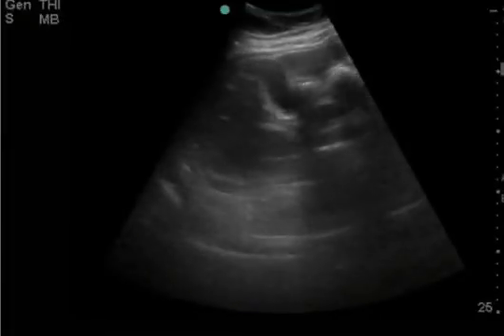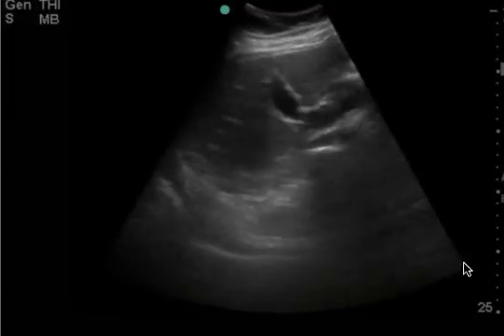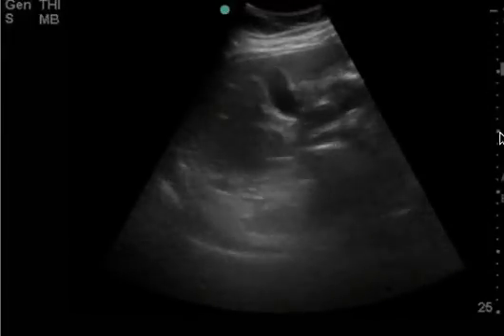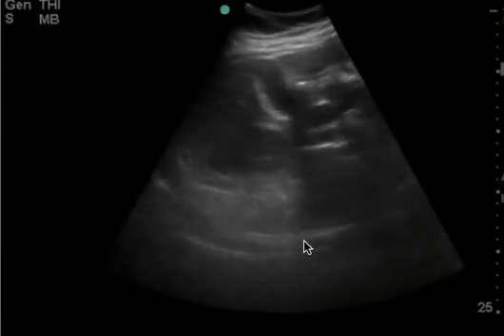This is a right upper quadrant ultrasound to evaluate the gallbladder. The first thing I want you to focus on, this is why this is a challenging scan to read, is the depth. So look how deep you are. This is 25 centimeters. The gallbladder here is pretty much, I would say, 10 centimeters from the surface. So because of that, 15 centimeters is all dead space and unnecessary.